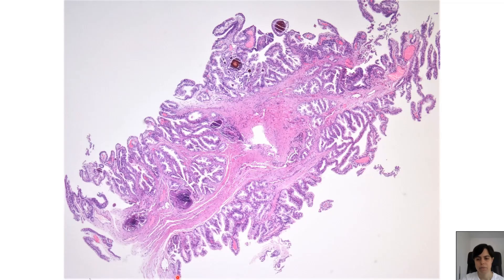Let's see some examples. This is a low-power view of a lesion which was described on the cystoscopy part as a small papillary mass protruding into the urethral lumen from the posterior wall.